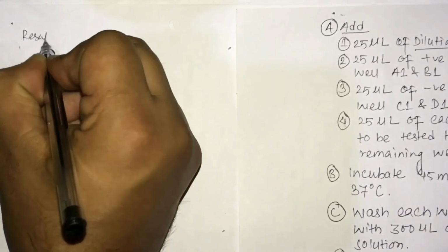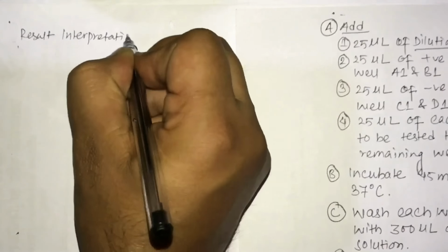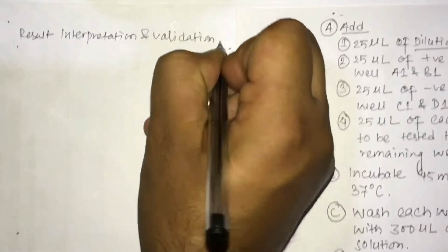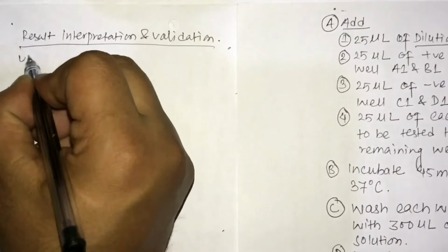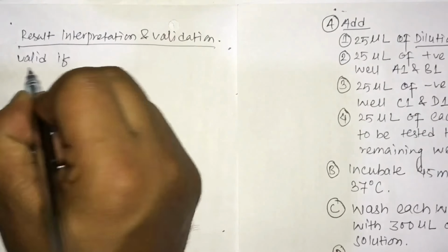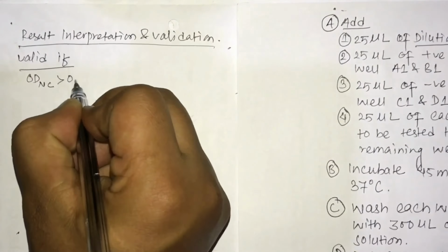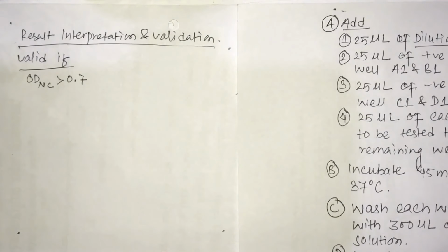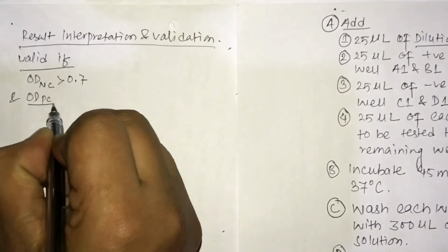Now for the result interpretation and its validation. The result is valid if the optical density of the negative control is greater than 0.7 and the ratio of the optical density of the positive control to the negative control is less than 0.3.